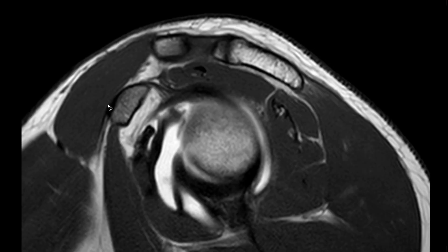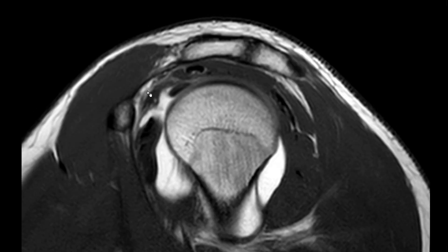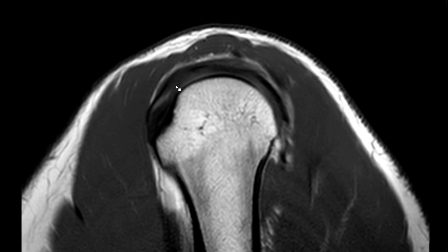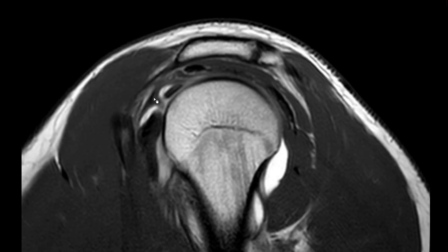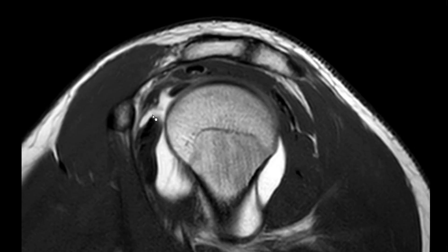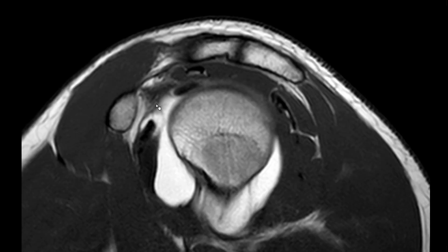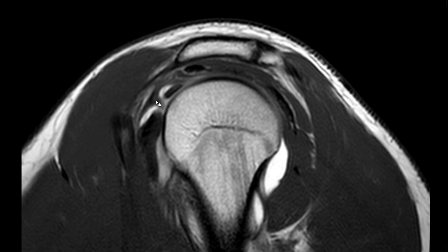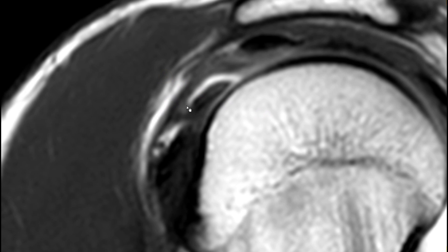Going medially, you can see the coracoid process, and the coracohumeral ligament is basically coming from the coracoid process in the direction of the humeral head, with some of these fibers blending in with the roof of the bicipital groove. This fold here — the joint capsule fold — is the superior glenohumeral ligament; initially it's just here, and if you go laterally it starts coming down and then forms this sling around the long head of the biceps tendon. This sling is the biceps pulley, preventing the long head of the biceps tendon from going down.